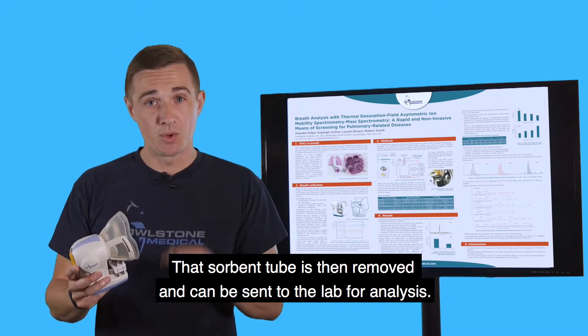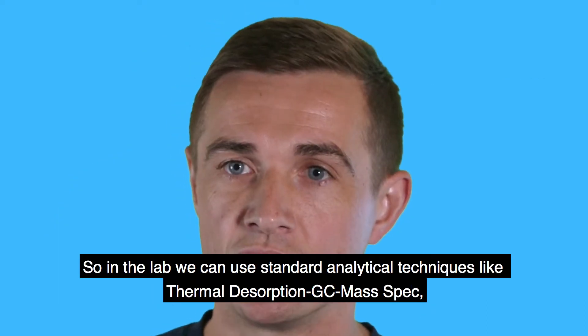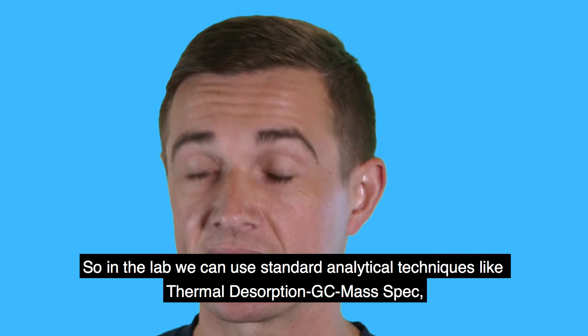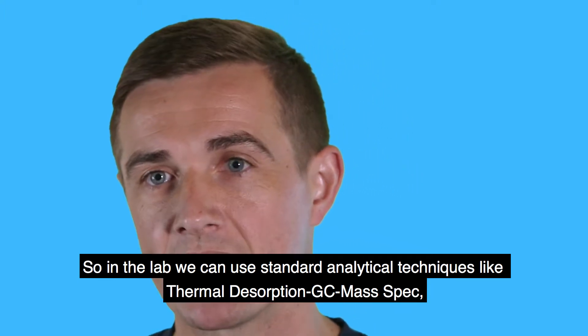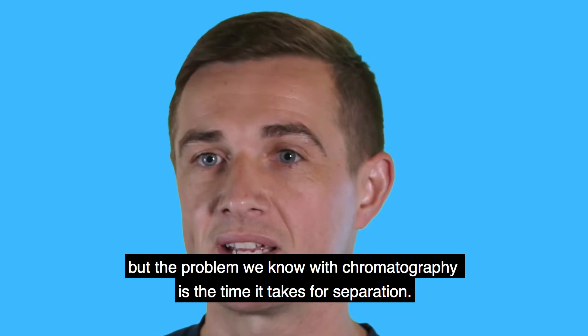That sorbent tube is then removed and can be sent to the lab for analysis. In the lab we can use standard analytical techniques like thermal desorption and GC mass spec, but the problem we know with chromatography is the time it takes for separation.